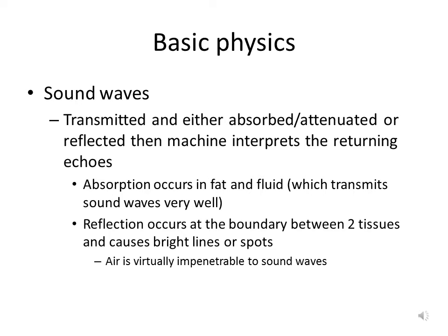They then expand and contract, forming sound waves, which are then transmitted into the body. Those sound waves are either absorbed/attenuated or reflected, and then the machine interprets the returning echoes. So basically, the probe is not only sending sound waves, but then listening for those sound waves to come back.